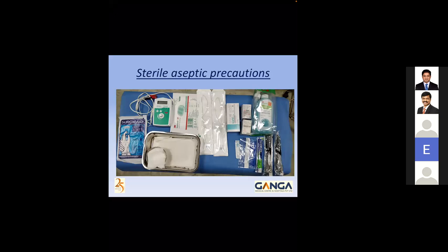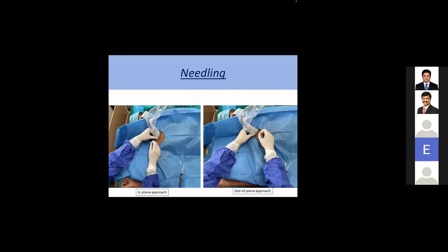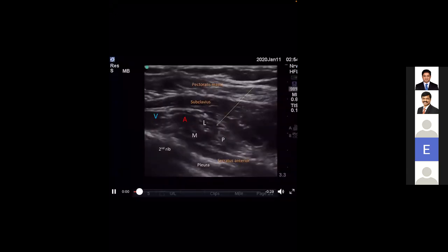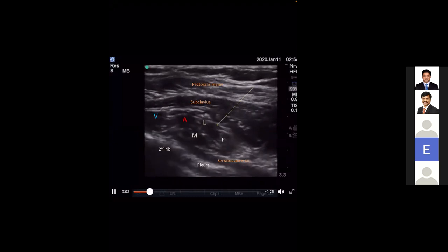The patient is placed in supine position. The needling can be either in plane or out of plane. I'm going to show the video of in plane. So this video shows the in plane approach of the costoclavicular block.